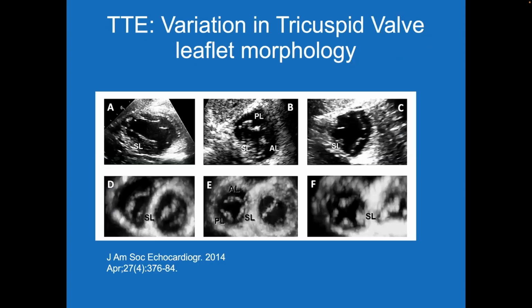That being said, there are times where, if the patient has very good subcostal images, you can get a better idea of the morphology in the short axis in the subcostal views, but this is not every patient. But you can definitely categorize them as the far left A panel, which is a bicuspid valve, the middle panel, a trileaflet, or the far right panel, a quadricuspid valve. And similarly, the 3D images mirror that at the bottom of the screen.